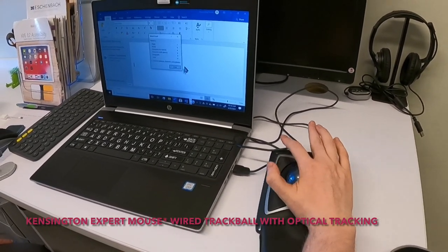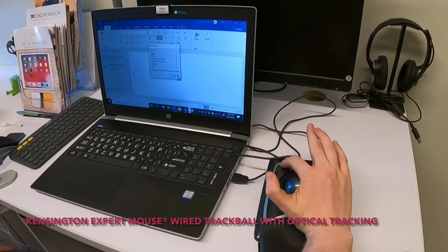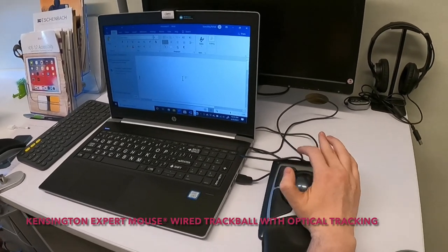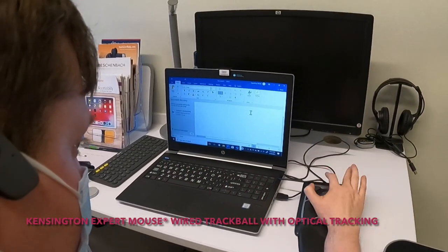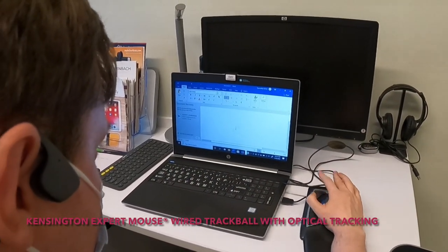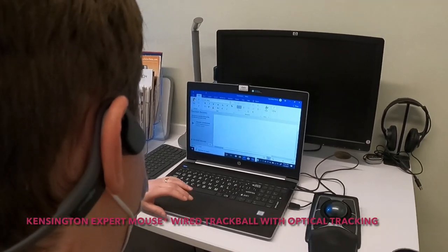Any of those buttons right now is a left click, so whichever one works for you. I think it needs to be a little slower for you — I need to set that up.